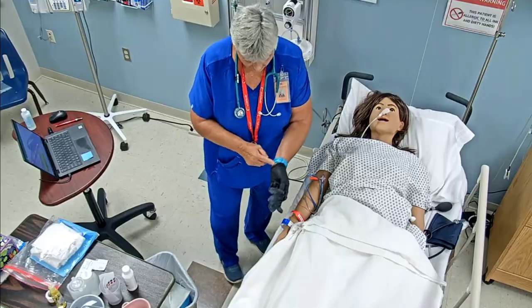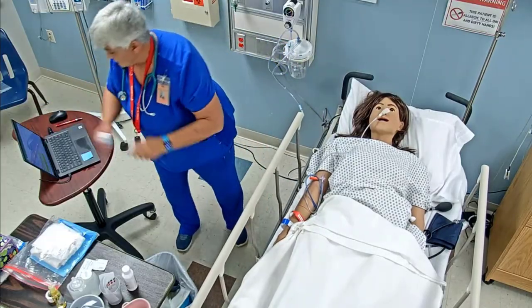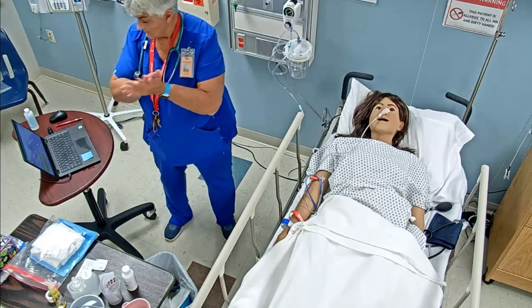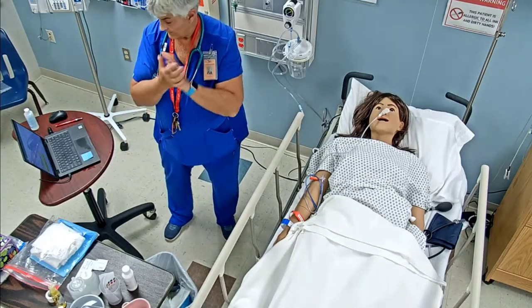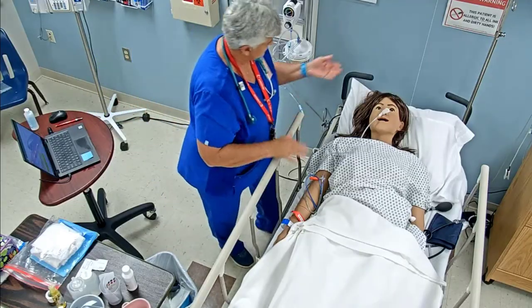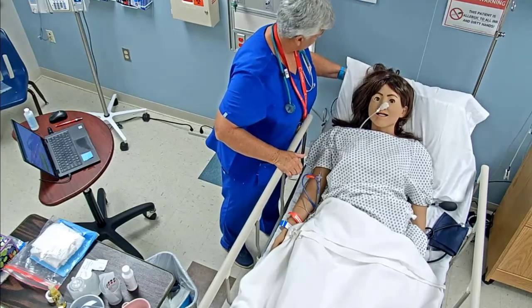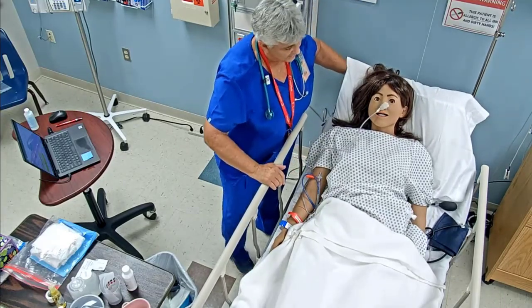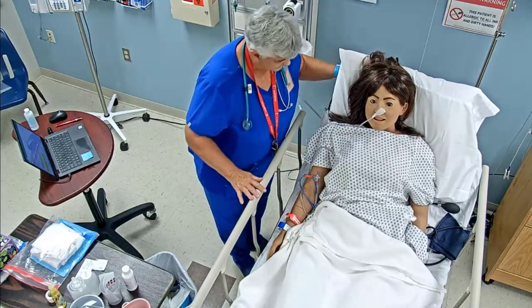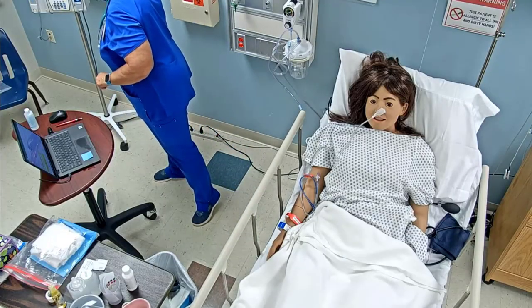I'm going to go ahead and take these gloves off, glove to glove, skin to skin. I'm going to do a medical hand wash. And now with this, we're going to go ahead and put your head all the way back up. We want it to be a high Fowler's if you can tolerate that, but if not, we'll do 30 to 45 degrees, okay? All right, let me go ahead and get some gloves on again.